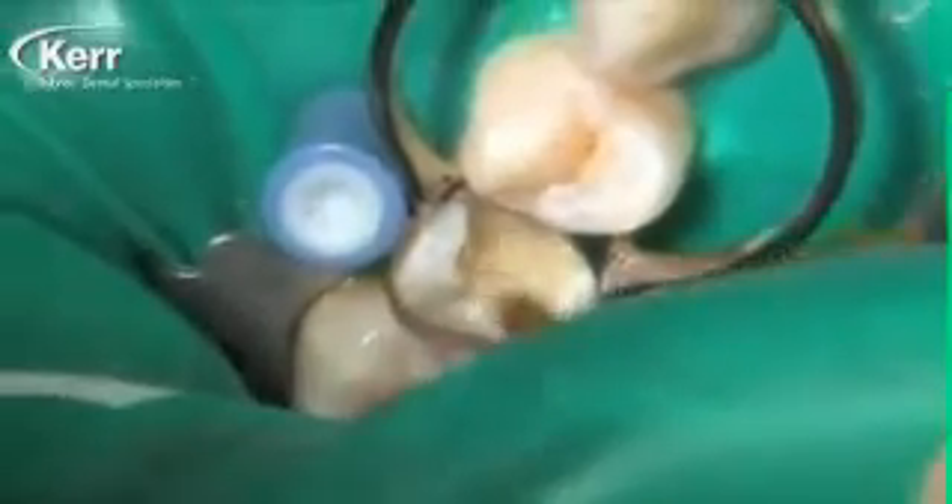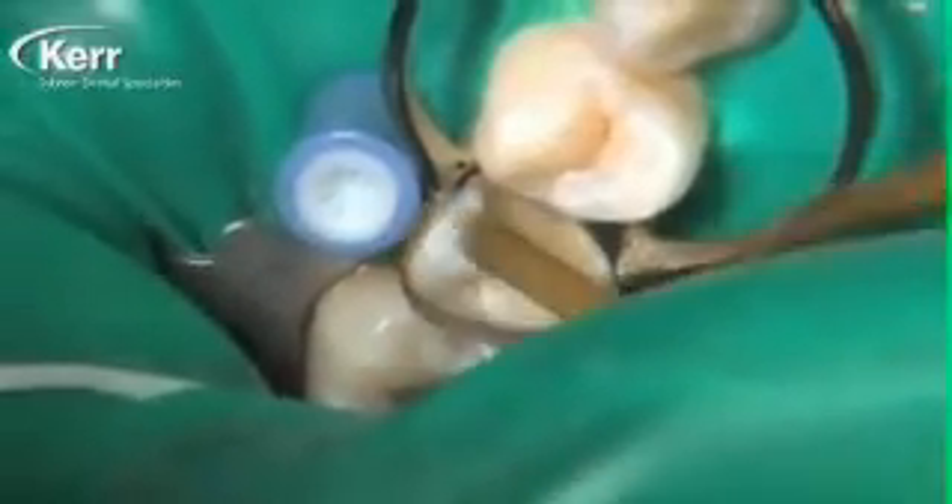Now we just treat it like a typical direct composite — we can place our composite on top of it. This happens to be Herculite Ultra, and I'm using a plastic instrument to put this into place and shape it.